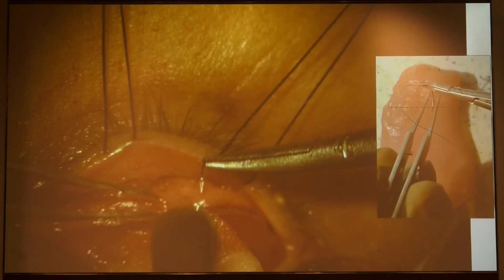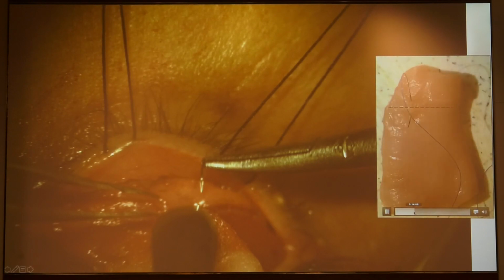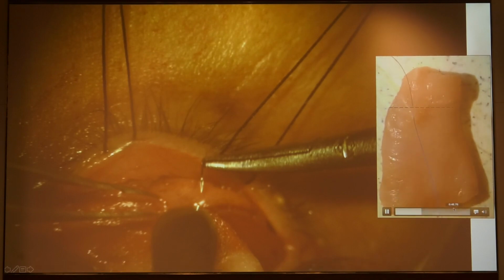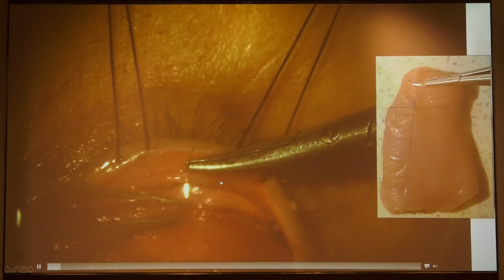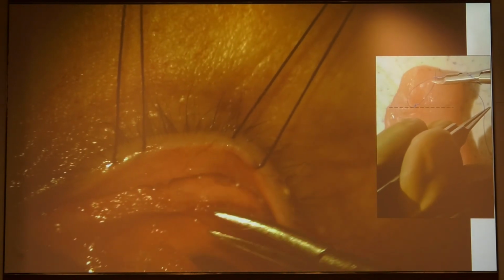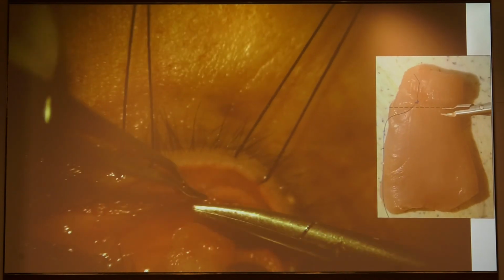So if you can see on the model, that is a vicryl suture 50, and you can see it is on either side of the wound. It's equal on both the sides, and the throws are taken and it is tied, and eventually the knot will be brought on one side of the wound. And you can see in this case we are just putting interrupted sutures. So this is good for closing conjunctiva. That is done with a vicryl suture itself. So that is a simple interrupted suture.